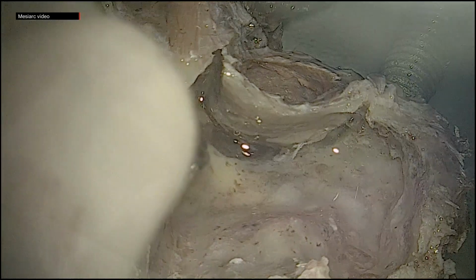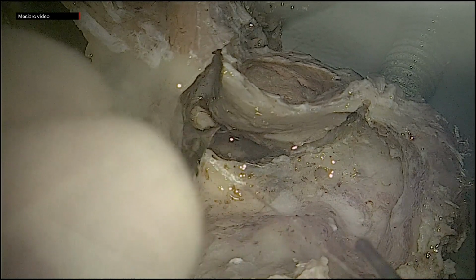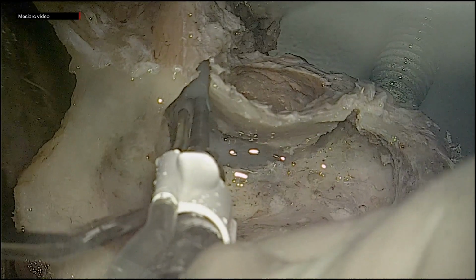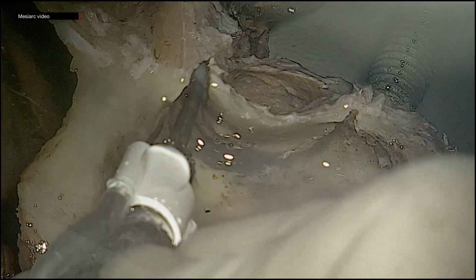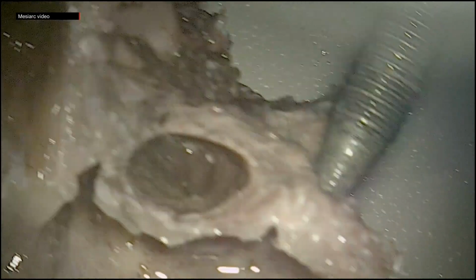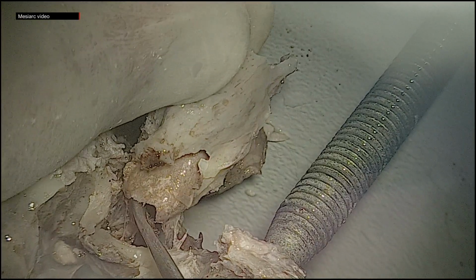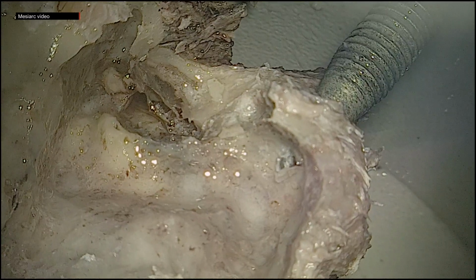canal wall is removed. This technique can be used in conjunction with an extended facial recess approach. Now, once the bone is removed, the whole mastoid, including the middle ear, becomes one single cavity, thereby allowing for easy access and drainage, and can finish in a completely epithelialized, well-healed, self-draining mastoid cavity. This is how the canal is removed. This technique has already been described in a sleeve resection of the external auditory canal.